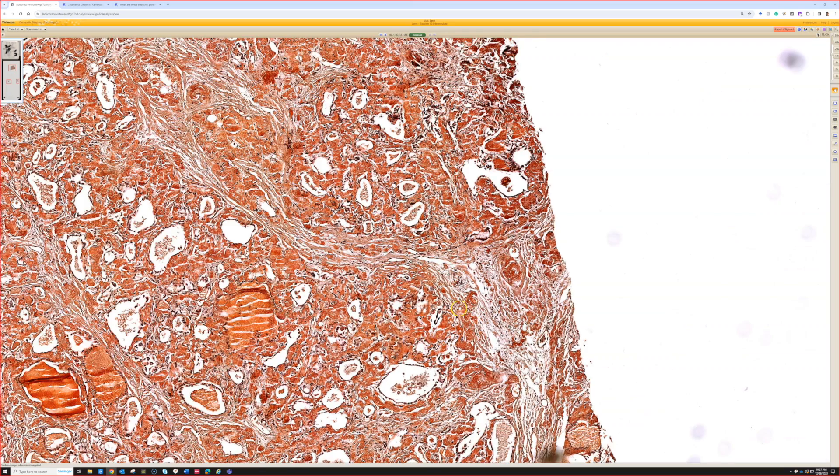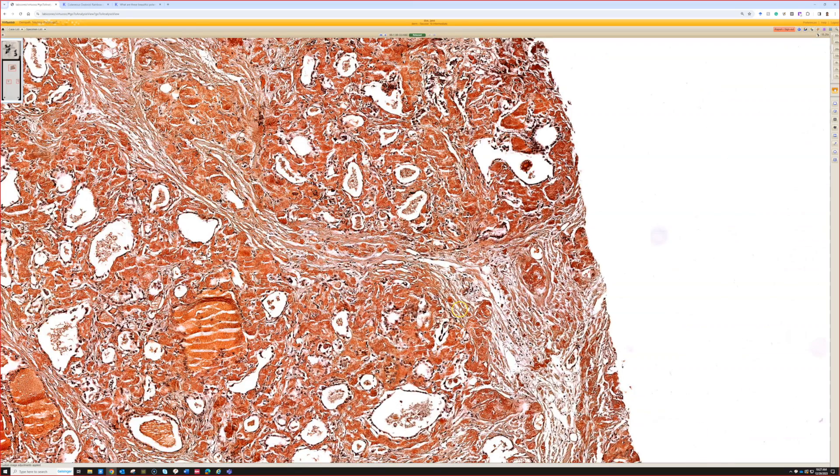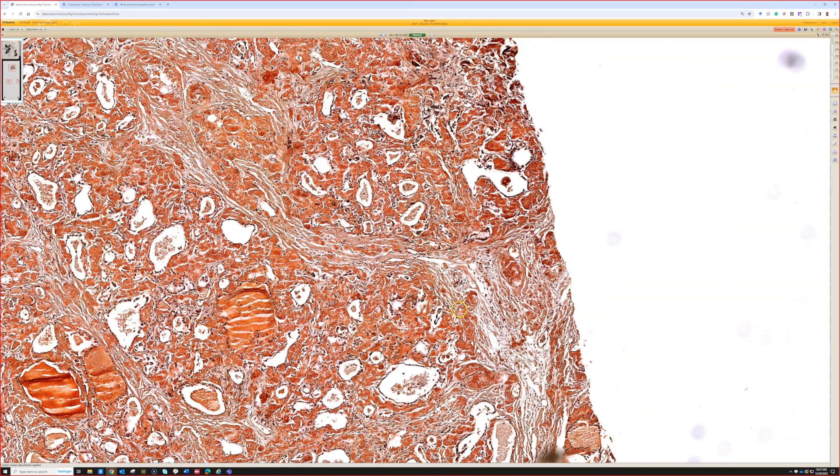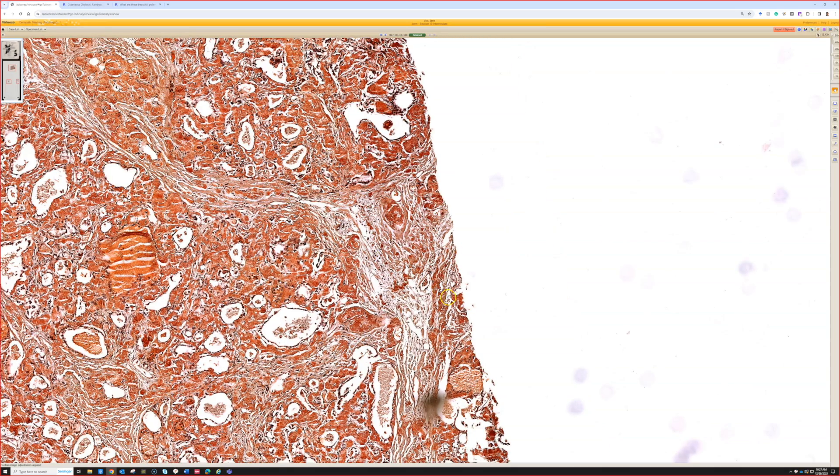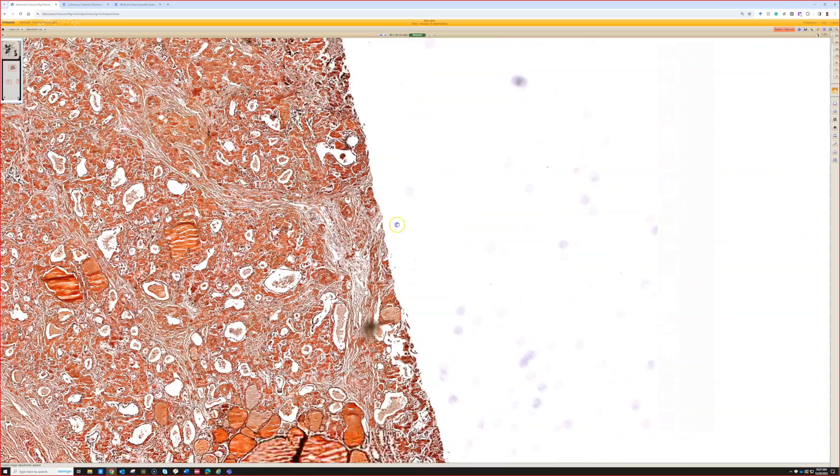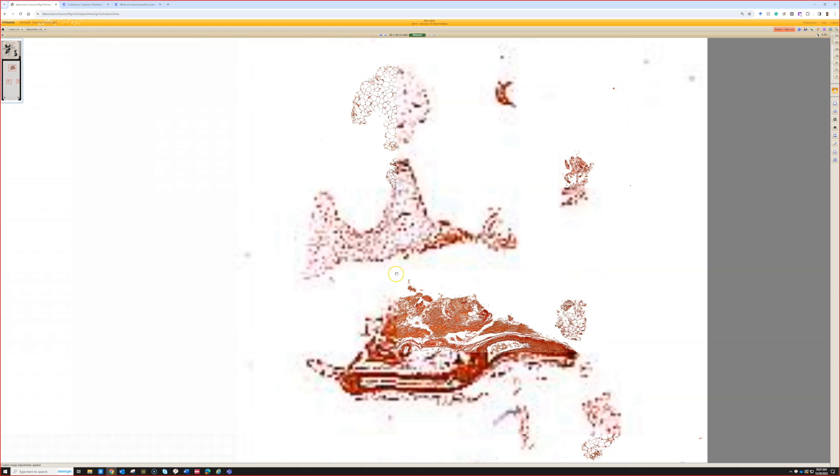Congo red usually looks more of a pink color than this. The problem I have is that Congo red seems to be kind of variable and has high background staining sometimes, so it can make it hard. Unless you have a bright enough light source on your scope, getting the apple green birefringence that everyone teaches you about in med school, getting that to work properly is quite challenging I find.